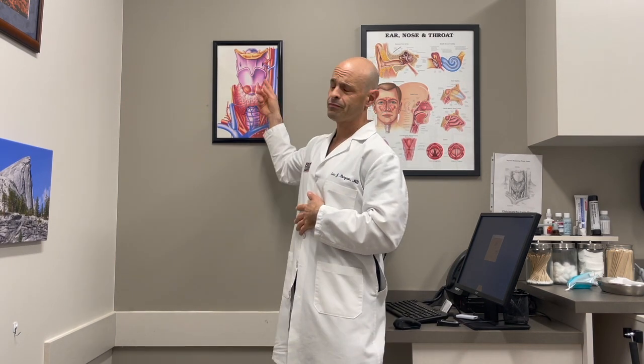It's a problem. So this use of the nerve monitor allows us to do what's called staging the operation when needed, meaning that after you remove your first side, you touch the nerve again. If you don't get your stimulation, if you don't get your beep, in many cases, most cases, we would do what's called staging the operation, which means we would stop at that point, even if we had intended to remove the other side. And we would just allow time to go by, whether it's a week, a month, 2 months, or 3 months, and we can monitor the function of the vocal cord by using a little scope in the office.